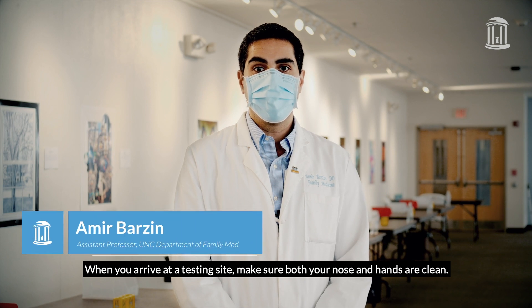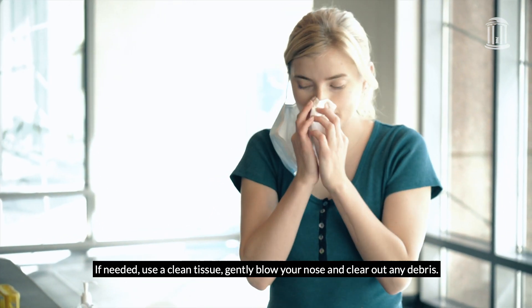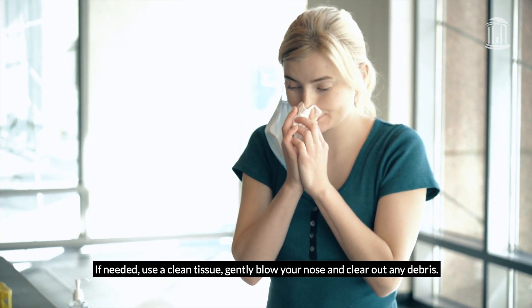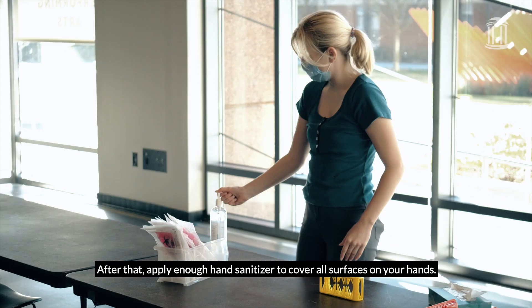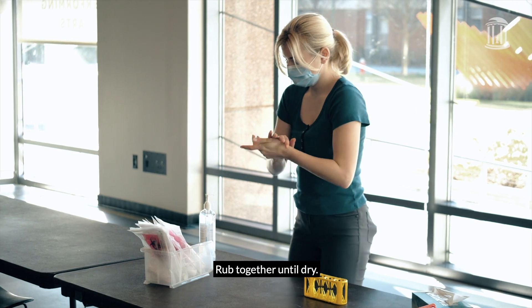When you arrive at a testing site, make sure both your nose and hands are clean. If needed, use a clean tissue, gently blow your nose, and clear out any debris. After that, apply enough hand sanitizer to cover all surfaces on your hands. Rub together until dry.